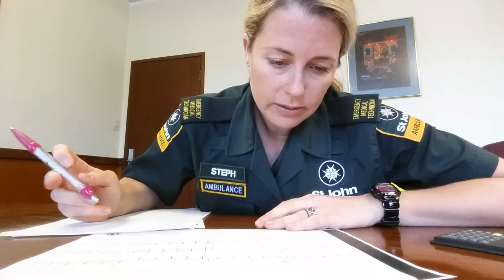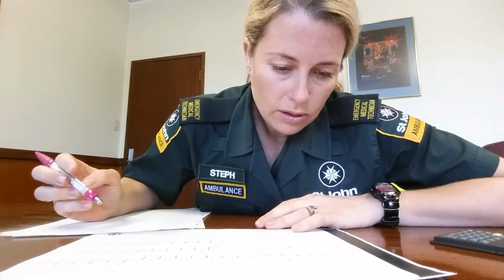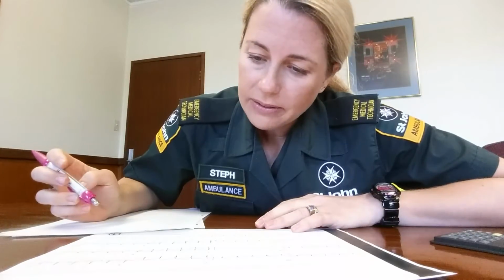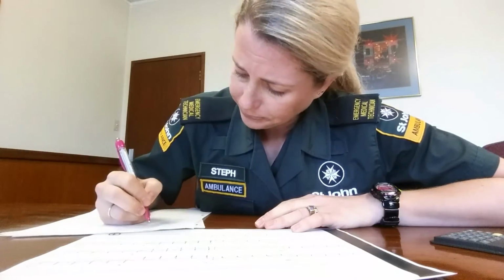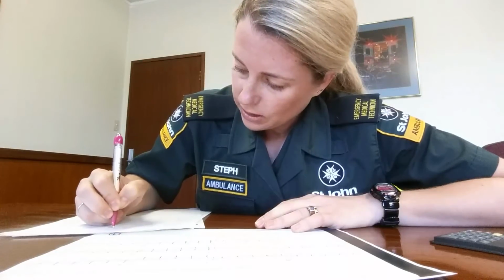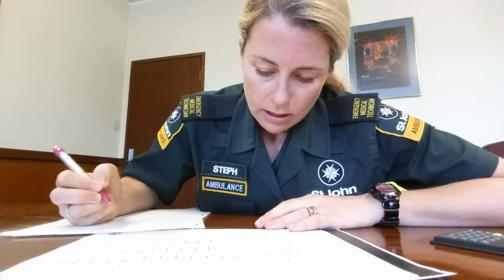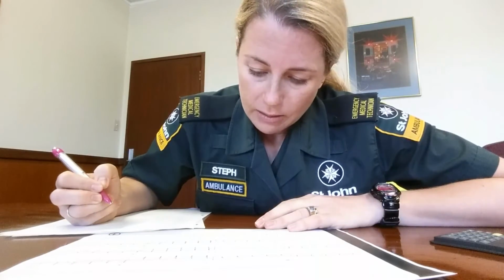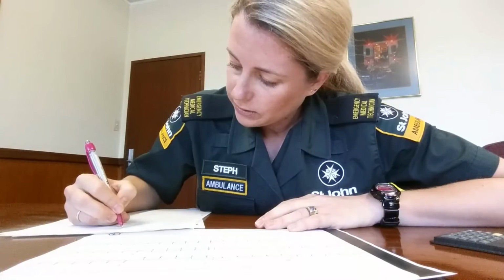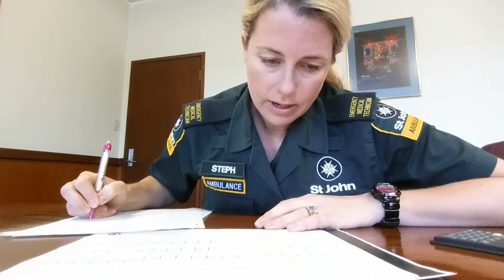Yes, I have P waves. They are symmetrical in 2. A bit biphasic in V1. So that is an intra-atrial conduction delay. But there is one for every QRS, so we're going sinus tachy for our rhythm.